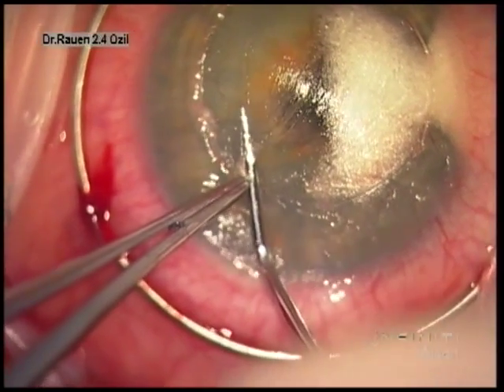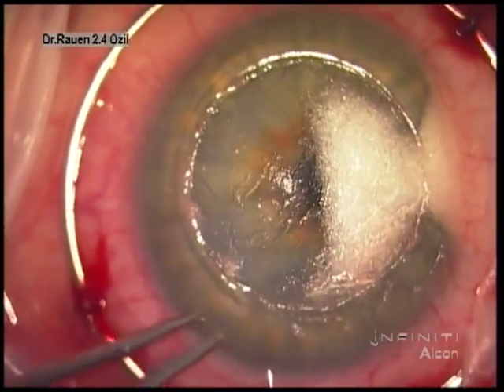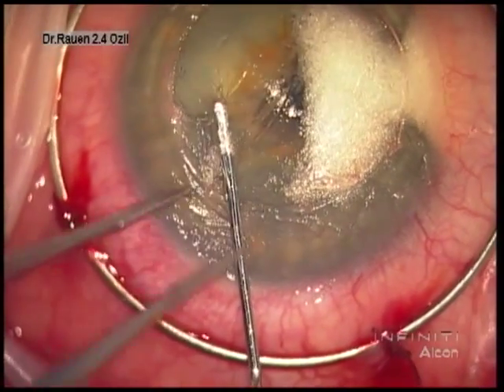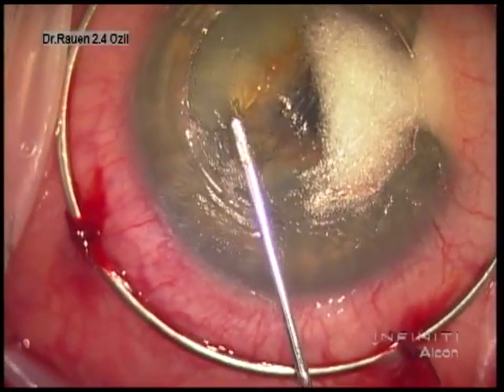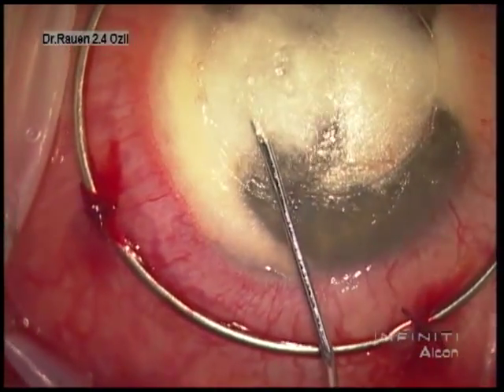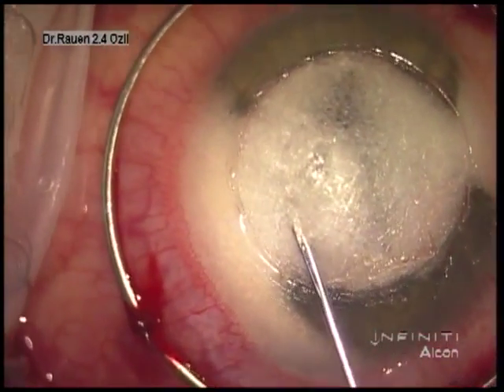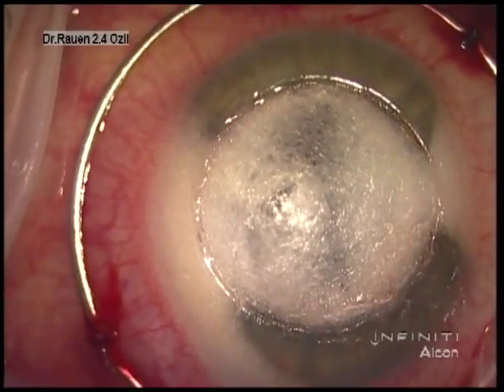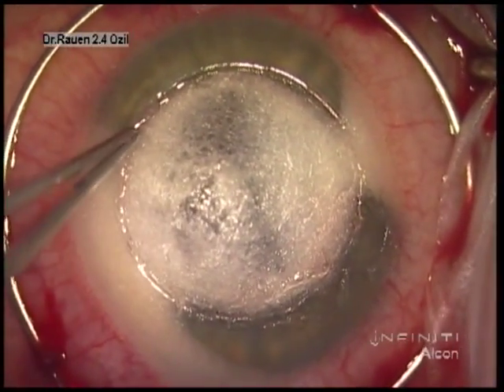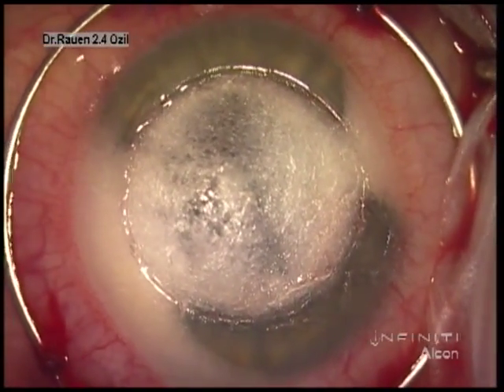We then follow this with the air dissector, which follows that same path. That's being advanced at this point. This is hooked up to a cannula, and at this point we'll generate the big bubble, which separates Descemet's membrane from the overlying stroma that remains. At this point the stroma that remains has bulged towards the operating microscope and we know we have the big bubble.